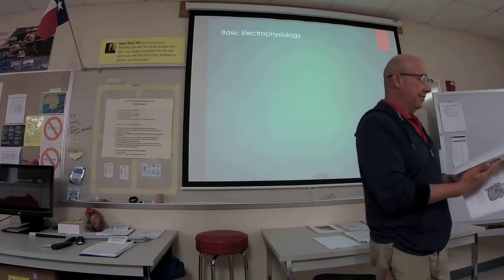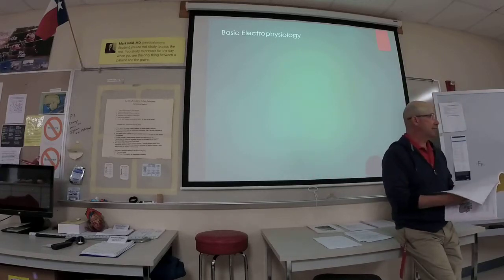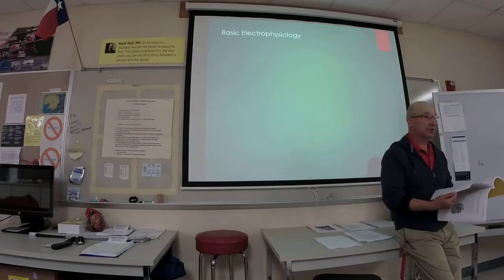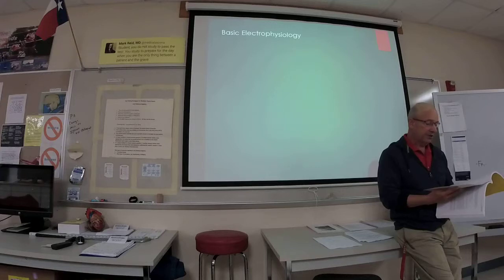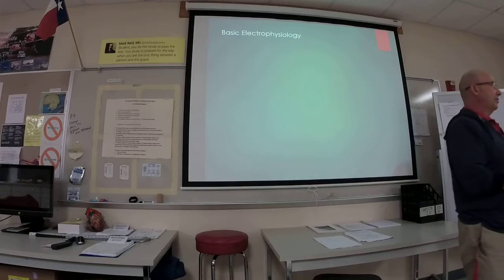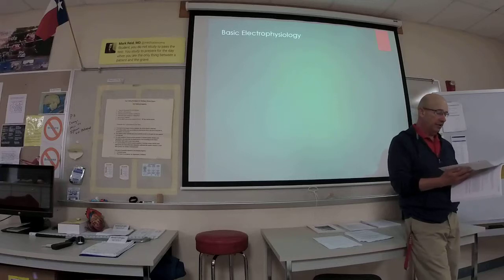The EKG is always going to be performed on an order. You don't get the order from the patient, you get it from a provider. The doctor or the nurse is going to say, go do the EKG, or hook them up on the EKG. We already understand that this measures the patient's electrical activity. You have to know the basic anatomy and physiology of the heart. I can't help you if you don't know that by now, but you do need to know that.